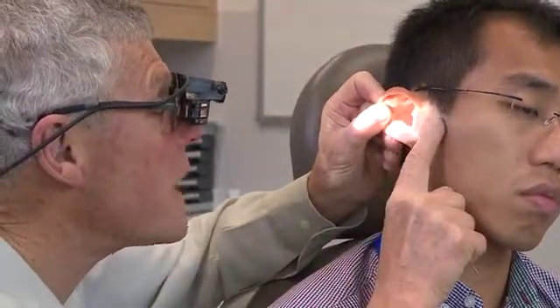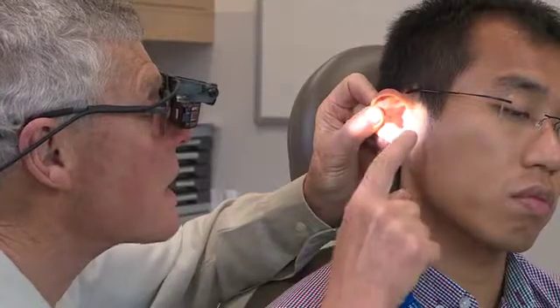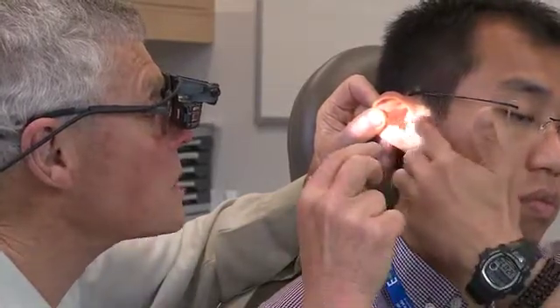Often it helps to have the tragus forward too. I've run out of hands, but that's why the patients have got hands. Could you please put a finger up there? He'll almost certainly pull it — no, not on, just in front of. That's right, and if he does it a bit hard, you move it back.